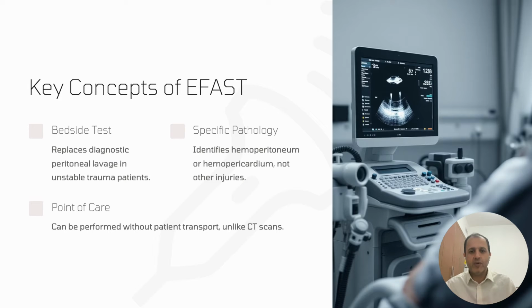So in these cases, there is no need to do DPL. And as we discussed, the goal of ultrasound like EFAST is just detecting free fluid. It is not to detect organ injury. You want to say, is there free fluid or not? And it is a very easy study.